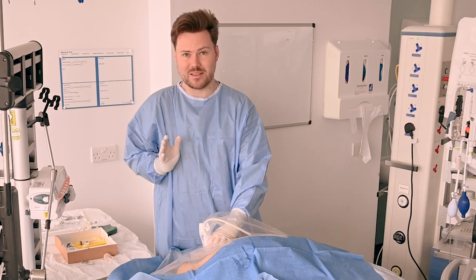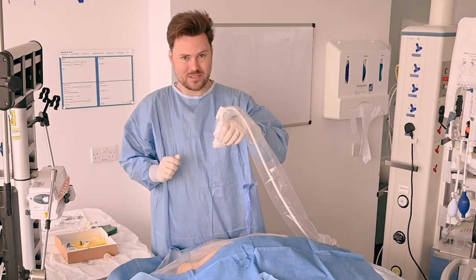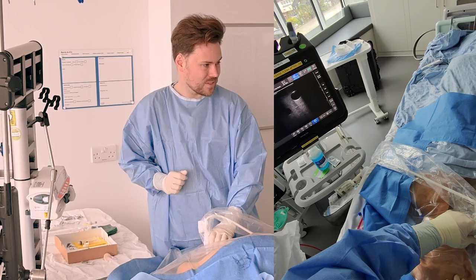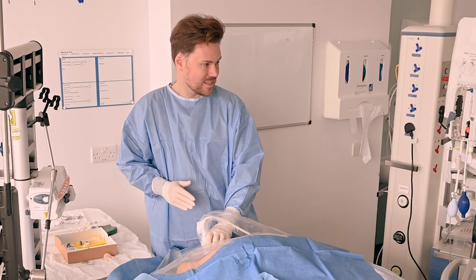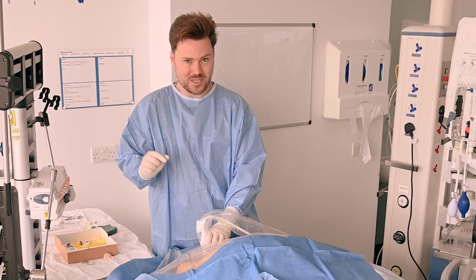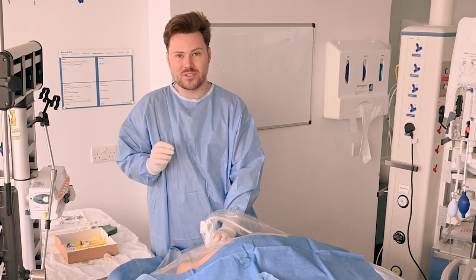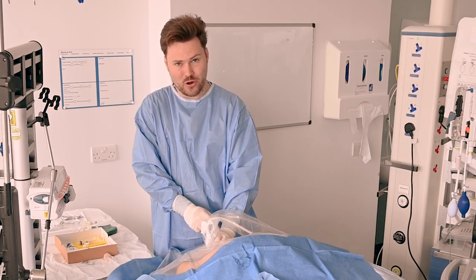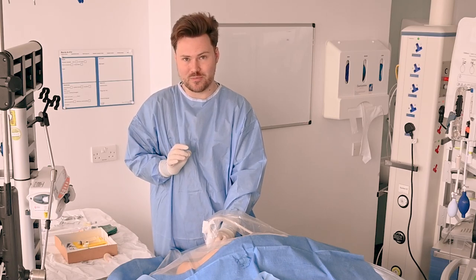Before I start I want to get the best possible ultrasound picture using a combination of position, tilt and rotation. Then map out where the vein travels so that as I move my probe forwards and backwards towards the chest and up towards the head, the vein stays in the centre of the screen — I don't want it crossing from side to side. Once I've determined where I'm going to go and the angle and direction I need, I'm going to anchor my probe against either the clavicle or the chin, something nice and solid so you're not going to move during the procedure.